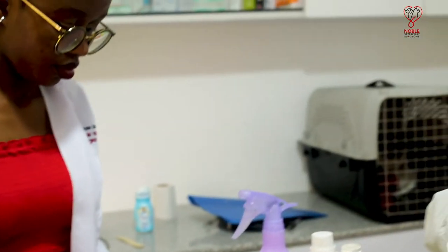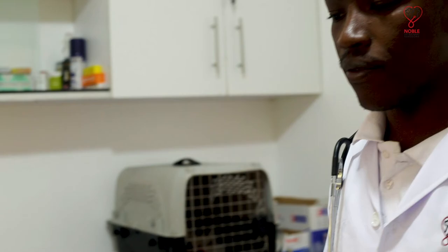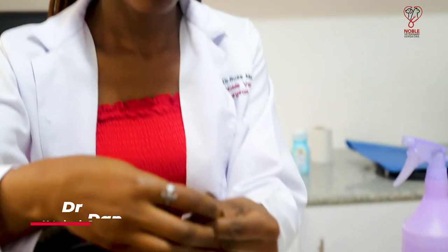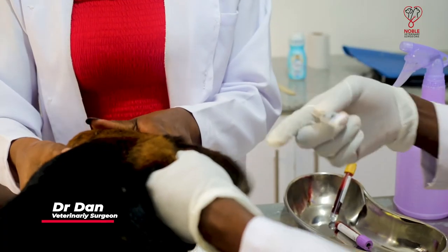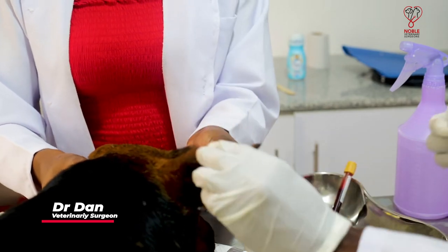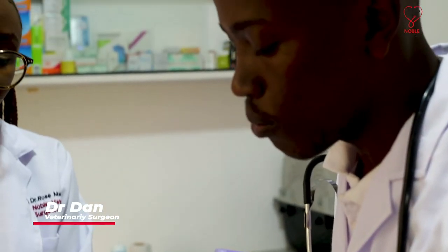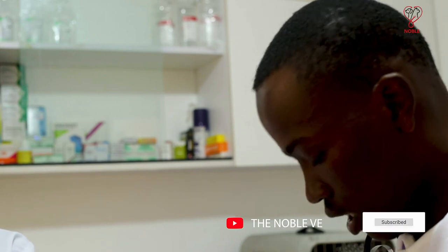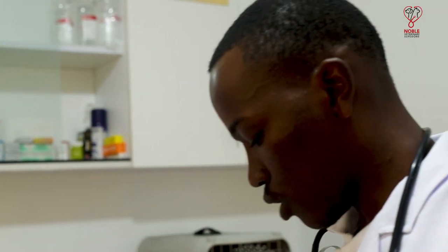Another important diagnostic test is the blood smear, which is taken from the tip of the animal's ear. For this procedure we shave a small site on the tip of the ear, then flap it a little so that blood can flow to the site, and use a small needle to prick the ear to get just a tiny drop of blood. This is to make a smear which can be examined under a microscope.